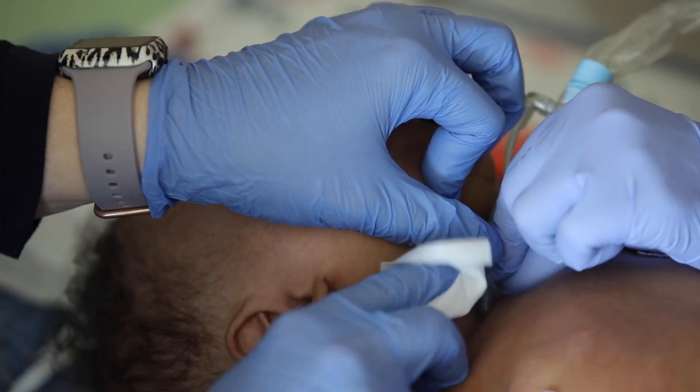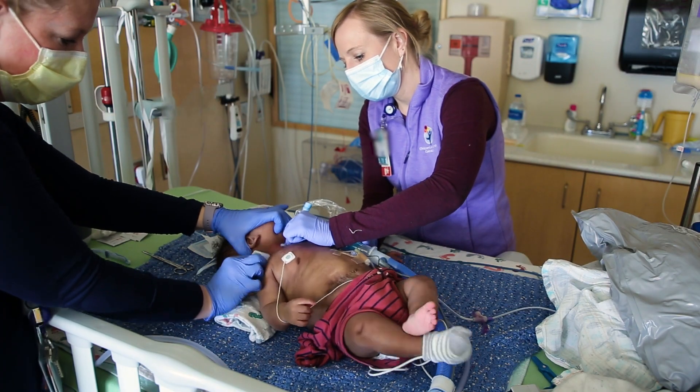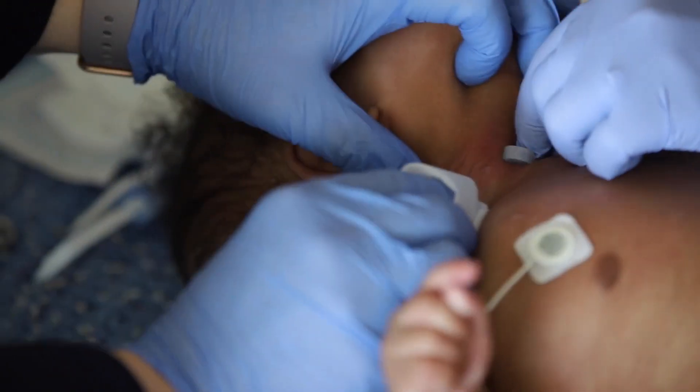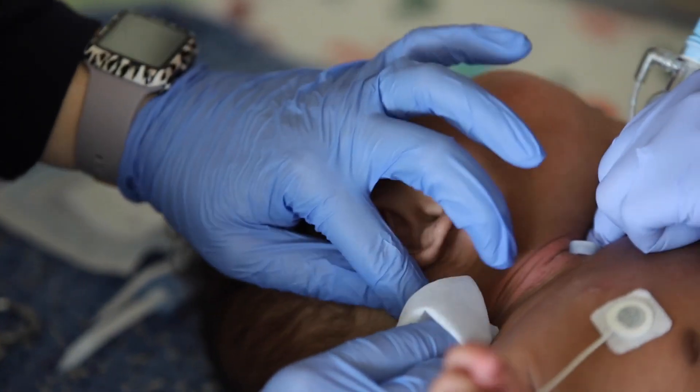Using a saline wipe, clean around your child's trach stoma starting at the stoma and working your way out. Then using the same saline wipe or a washcloth with mild soap and water, clean all the way around your child's neck.